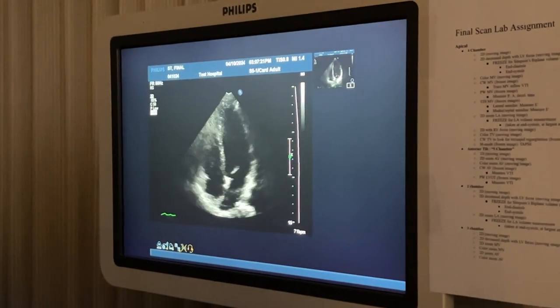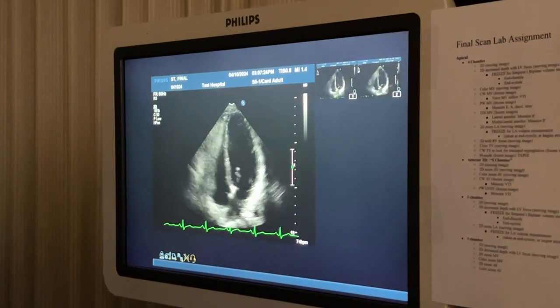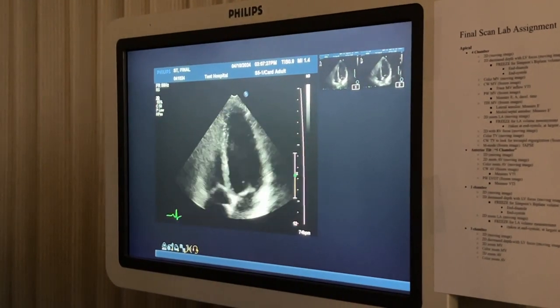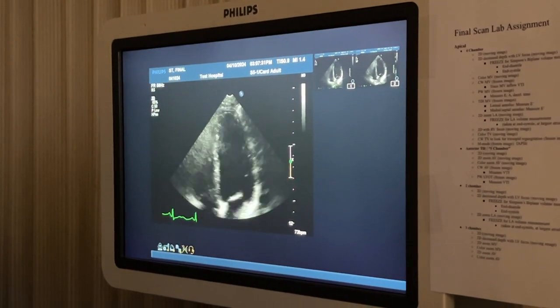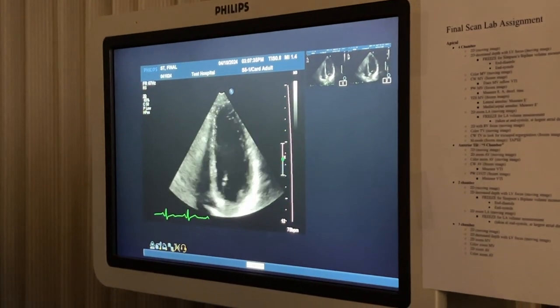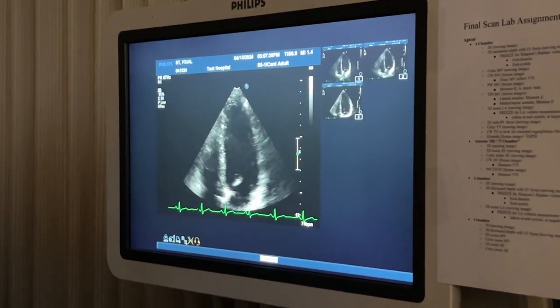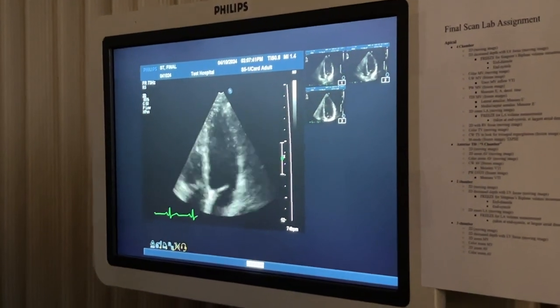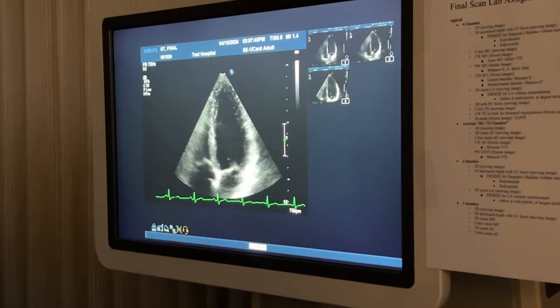Oh, I'm in res. Wow, that's crazy. All right, I'm gonna take another one. And then I'm gonna decrease the depth on the left ventricle. I'm gonna focus nice on it. And I'm gonna narrow my sector width. Looks really good. You wouldn't narrow it more than that. No, I don't think so. Because if I do that, I mean, I could narrow it a little bit more, but I don't really need to. My frame rate and everything is looking really beautiful.